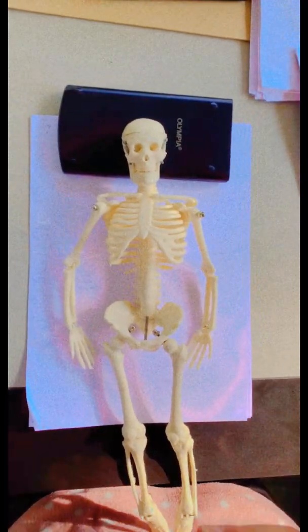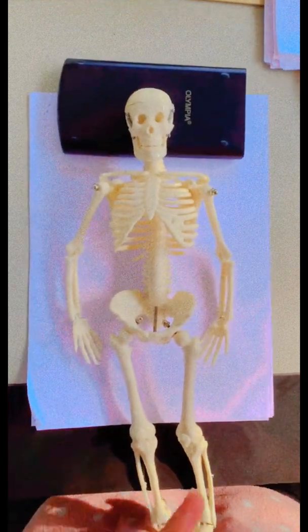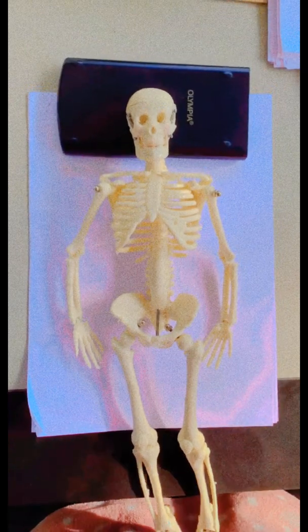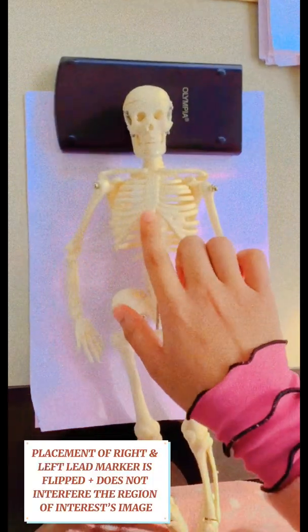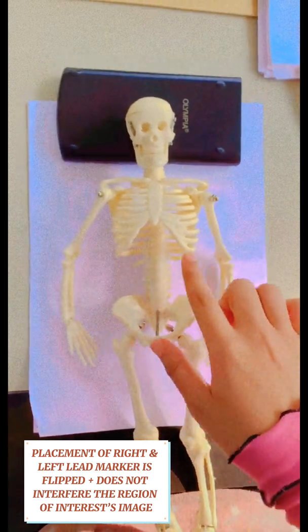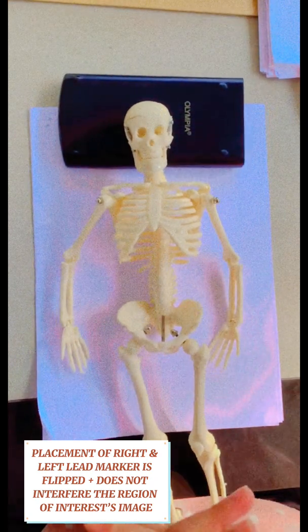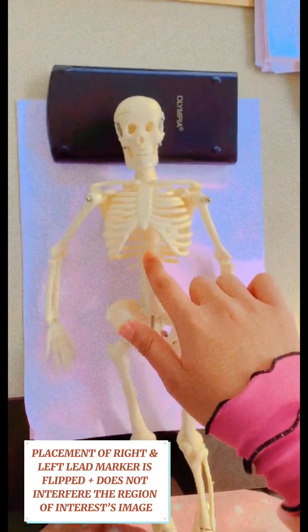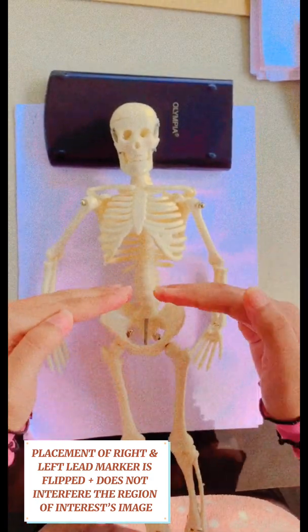For the below diaphragm projection, it's similar to the above diaphragm, the only difference is at the center ray, the collimation, and the respiration. For the CR, we're going to do at the level midway between the xiphoid process and the 12th rib, which is the lower rib cage. So this is the level of the CR. Then for the collimation, we're going to include superior to T9 and inferior to the 12th rib or above the iliac crest.